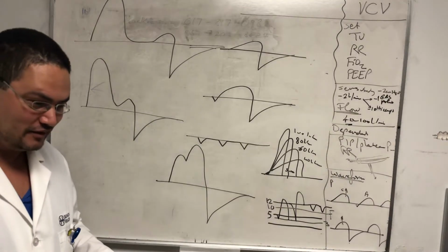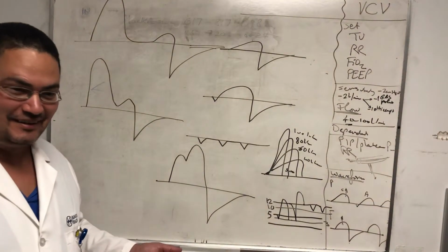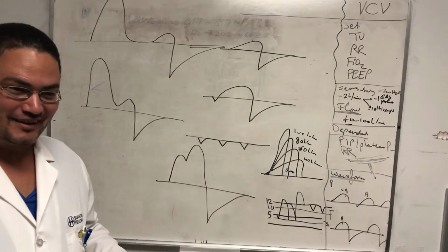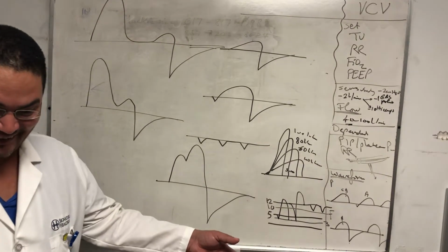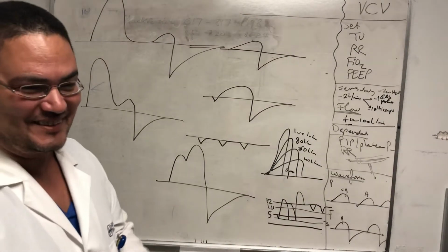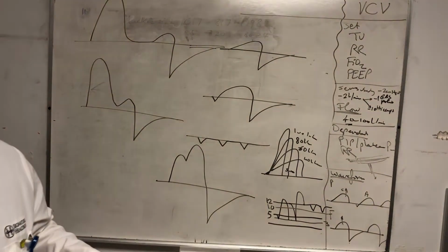You really have to listen to the patient. You give the vent, and the vent looks like a piece of furniture, huge. It's like, okay, let's take it off and just ventilate the patient. I don't know what's going on.